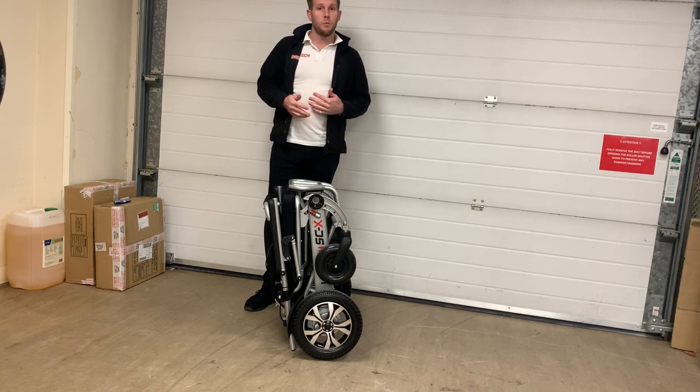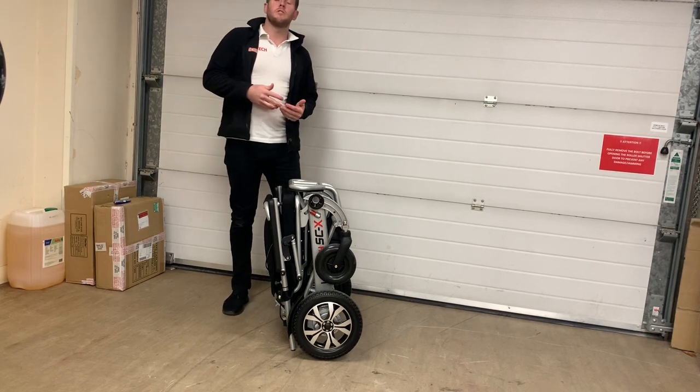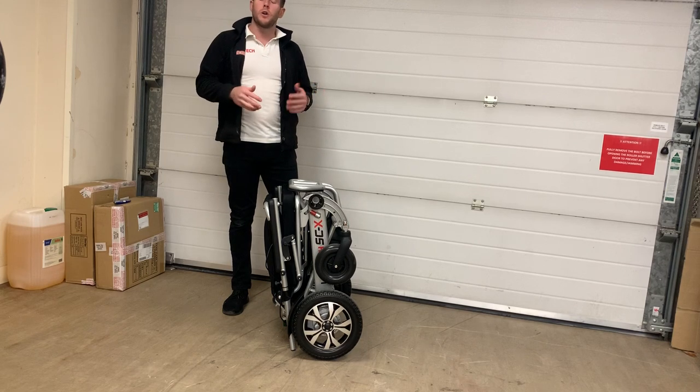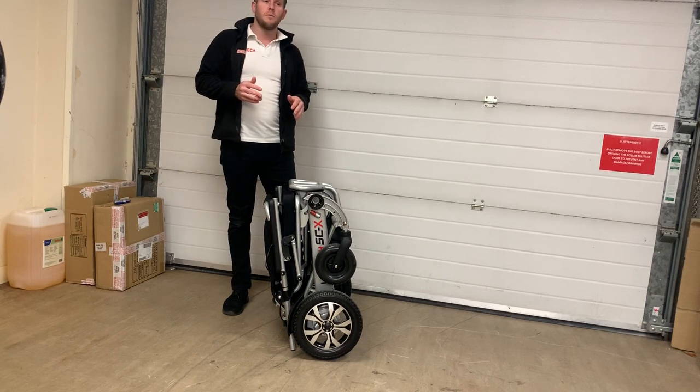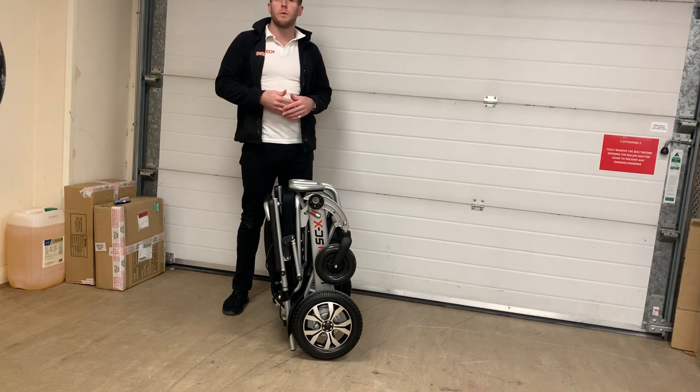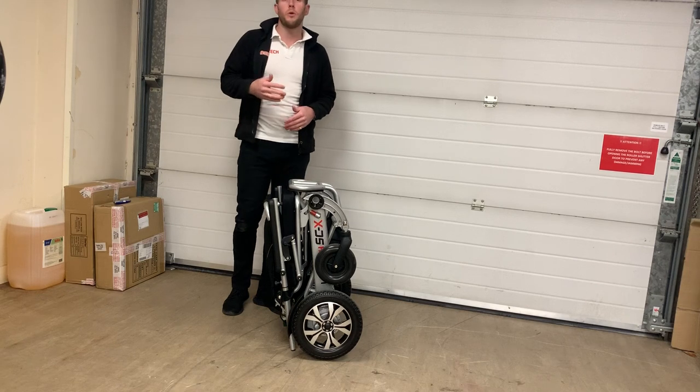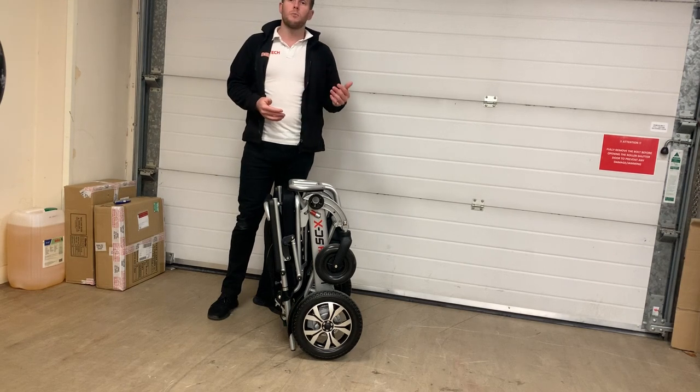The type of user this would be really good for is someone that either lives in the countryside — so they like their country walks, maybe have dogs, go on uneven wooded country paths, have kids or grandchildren playing in the park with them — or this would really suit the city type: people that are always coming up to kerbs, have cobbled streets.